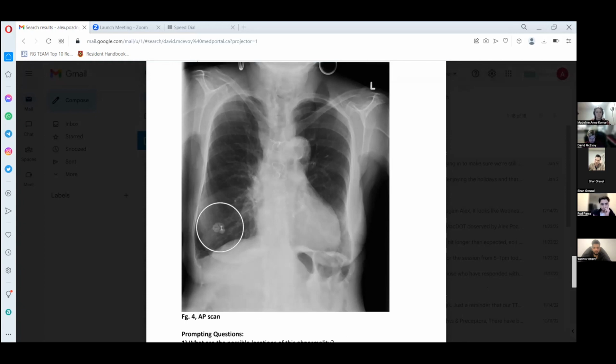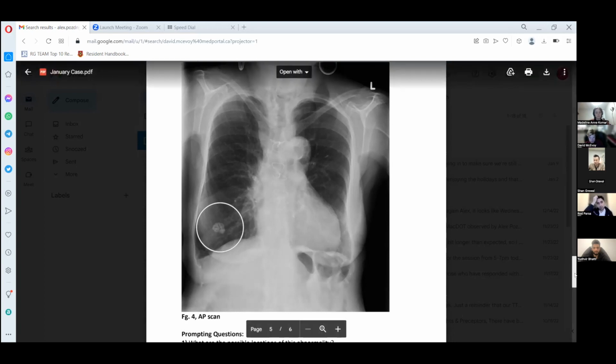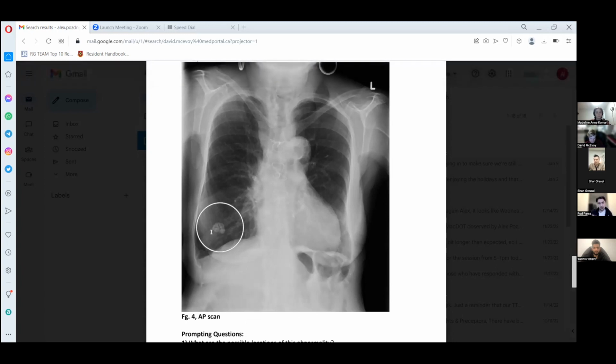That's why it looks a little bit lobulated and a little bit unusual. If it happened to be in the lung, I could think of some differentials like a calcified lung nodule or a very large granuloma, which, once again, you don't have to really worry about. It's a benign mass, and also it's not really a very introductory thing to know about. But I think the shape of the lesion can certainly help you with the differential diagnosis if you know what different lesions look like, but it won't necessarily help you with localization as much.